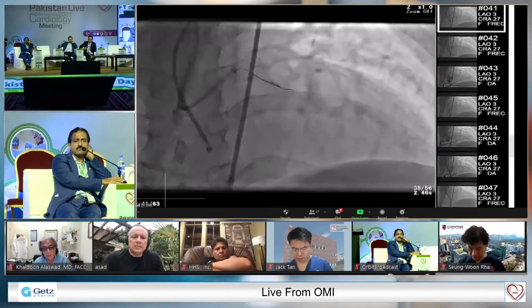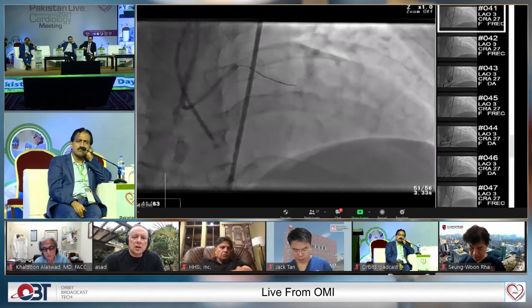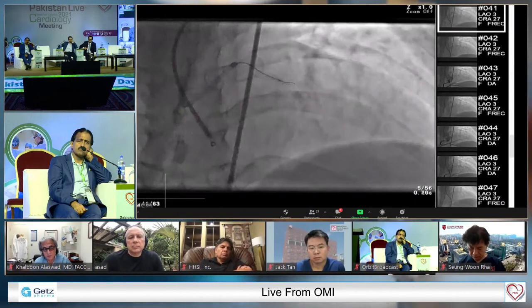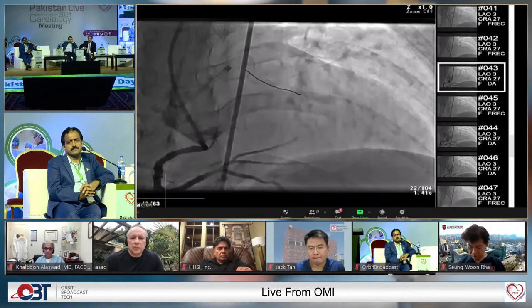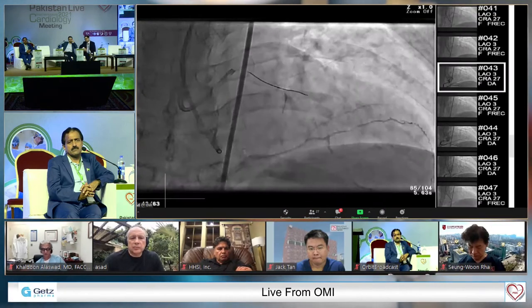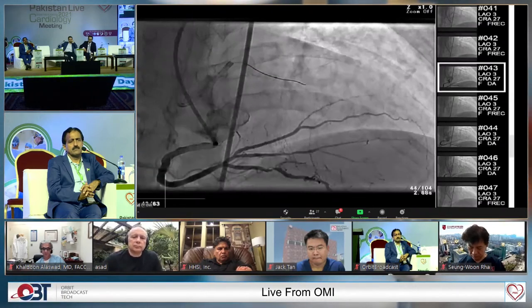Thank you. So you can see that I'm just doing 180 turns with a Pilot 200. Next please. And we gave a right injection. Next please. And just see, I think we're approaching it quite well. It seems to be quite well lined. The wire is making good progress. We progress some more. Next please.